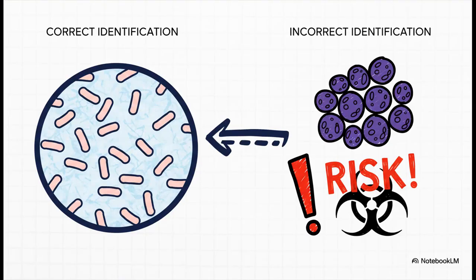Here it is, the first and maybe the most dangerous trap. Brucella melitensis is this tiny little coccobacillus, and it stains gram-negative so faintly it's like a ghost on the slide. It can really easily hold on to that crystal violet, especially if it's coming out of an automated blood culture system, and trick you into thinking it's a staph species. And that mistake, that's how this pathogen ends up on an open bench. It's a scenario we all dread.